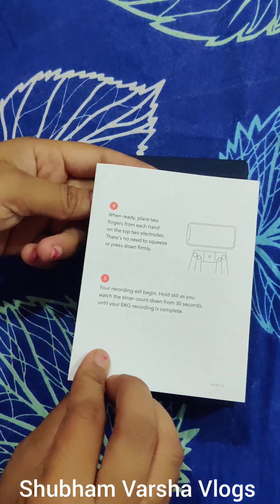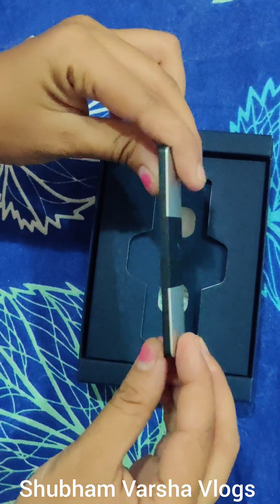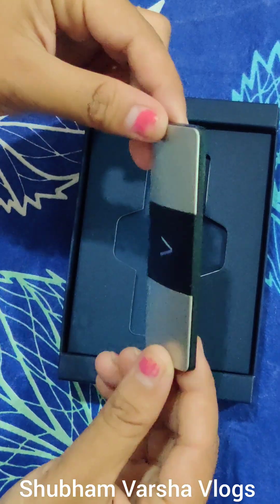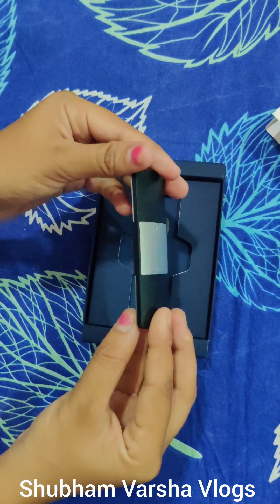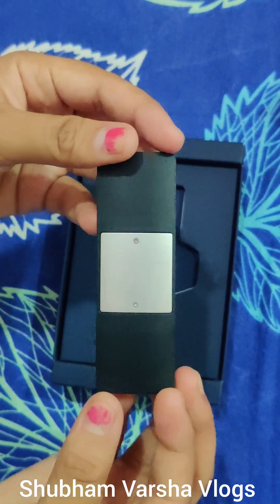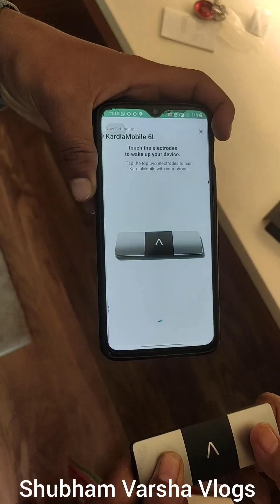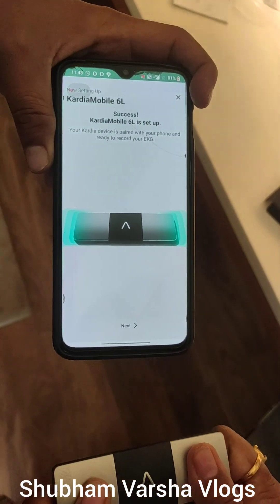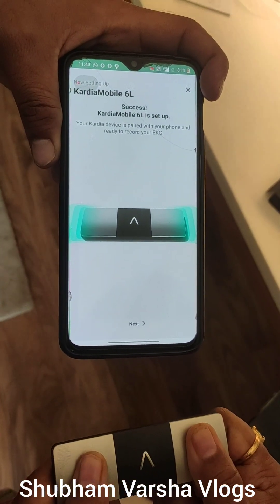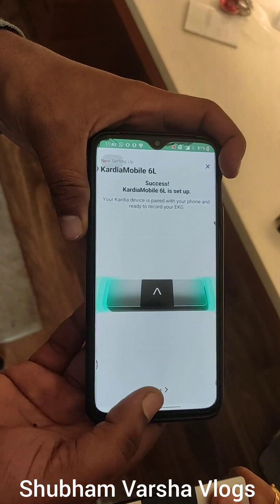Here is the manual guideline and this is a hand carry portable ECG device through which we can take our ECG. First of all we have to download the Cardio Mobile 6 Lead App on your Android or Apple phone. It is easily available in the store. Then follow the instructions and press the next button.